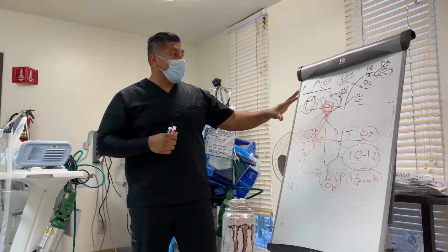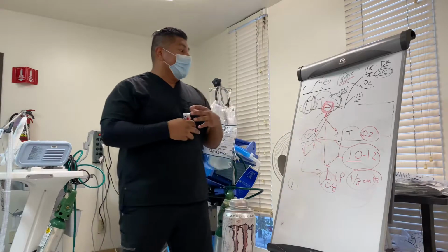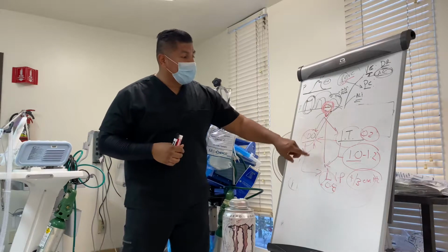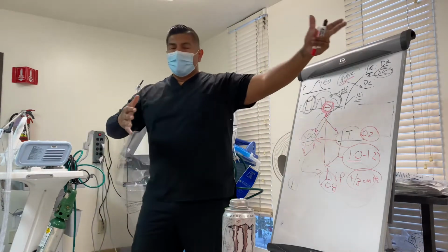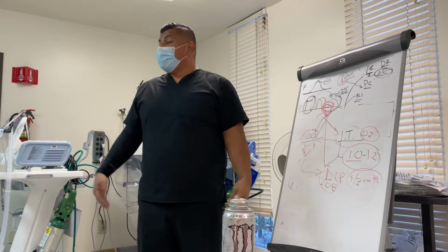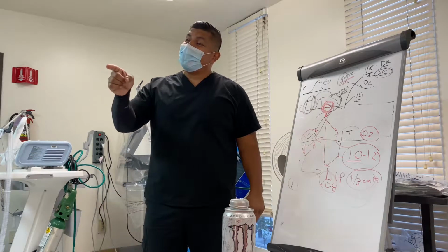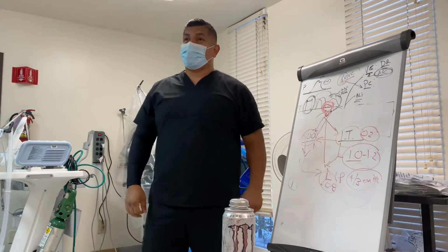We have an ideal situation inside the lungs where we can get adequate tidal volumes at a lower inspiratory pressure. Now, here's the thing. Remember we said flow equals pressure? I can do this same thing on volume control, but are you going to sit there and measure every single breath and adjust the flow? No. Let the machine do it for you.